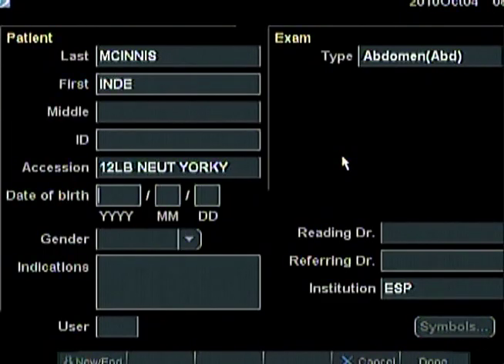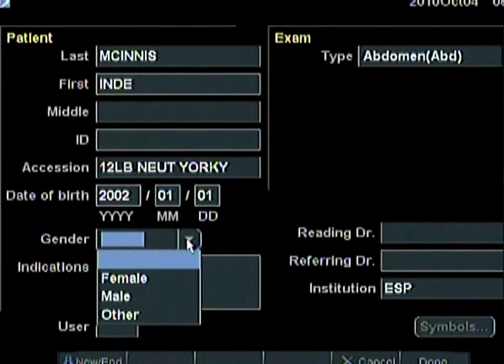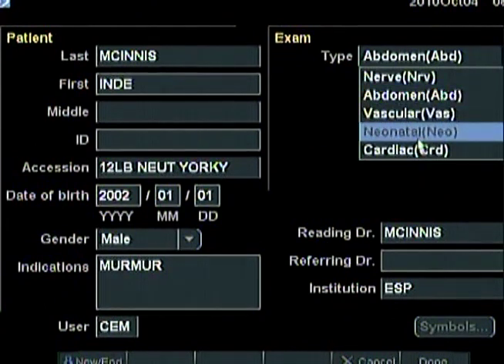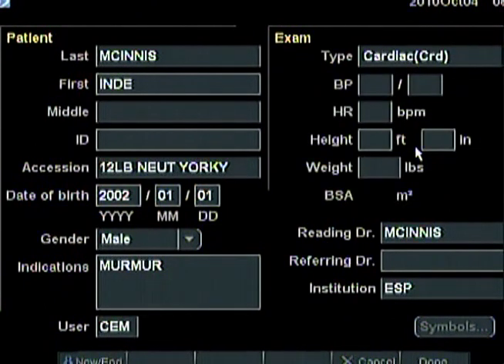Many ultrasound machines will eliminate any current calculations when you change to a new patient, so you should save an image of any calculations you will need to review in the future before you establish a new patient record. Choosing the cardiac exam option will optimize the machine's presets for a cardiac examination and reverse the index indicator on the ultrasound screen.